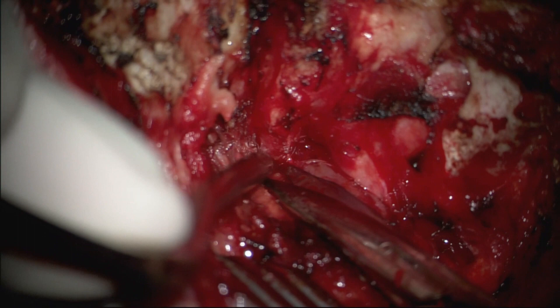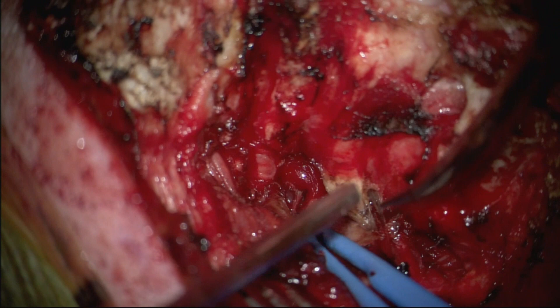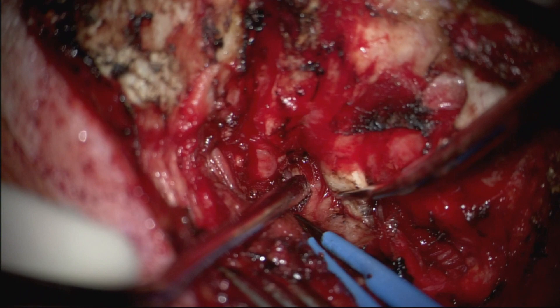The C2 nerve root is similarly cauterized and transected in order to give access to the vertical segment of V3. This is a key step anytime the ascending segment of the vertebral artery must be localized, as well as being an important landmark for the identification of the C1-C2 joint. Pre-ganglionic transection prevents neuropathic pain.